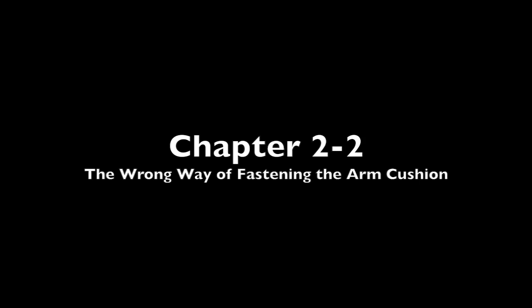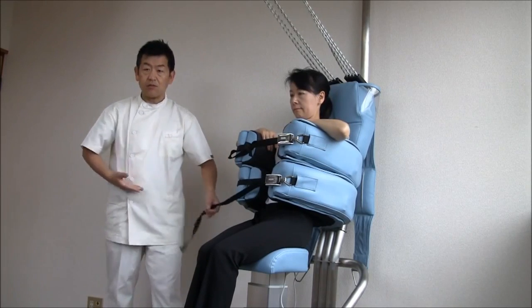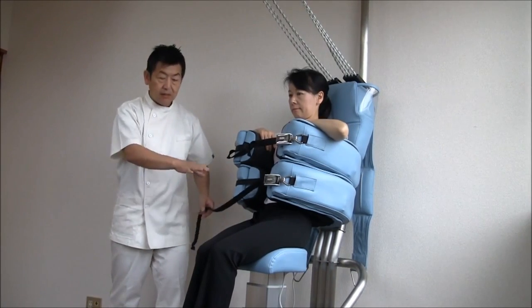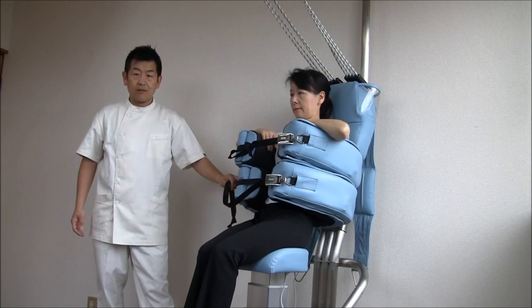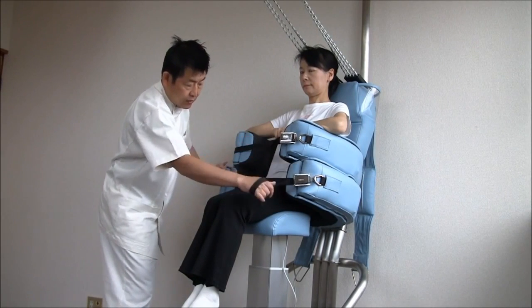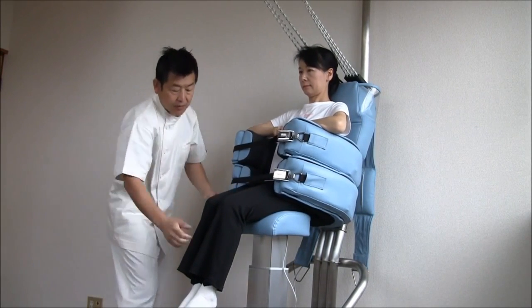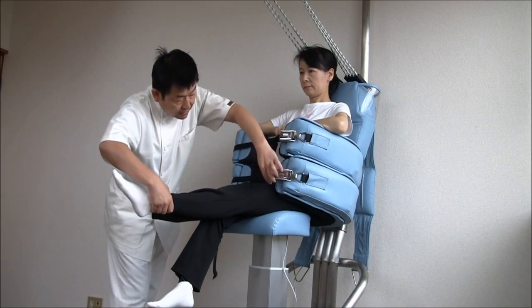Chapter 2. Wrong way of fastening the arm cushion. Here, there's too much space between the lower cushion and thigh. In this example, the seat is too high. The physical exercise is constrained by the cushion.